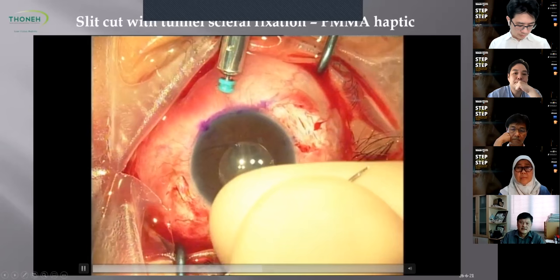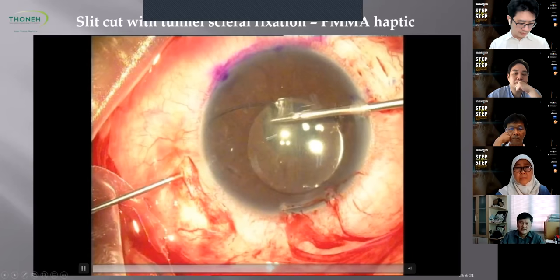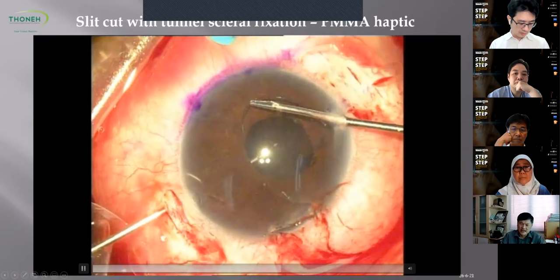Then the 25G forceps is used to enter the sclerotomy. And a 23G microforceps goes through the paracentesis to catch the haptics. The objective here is to catch the tip of the haptic and externalize the haptic.